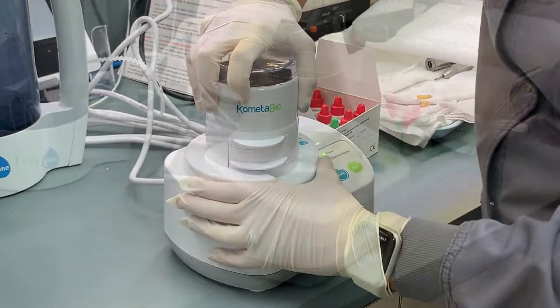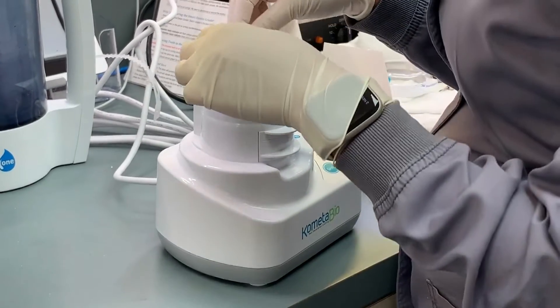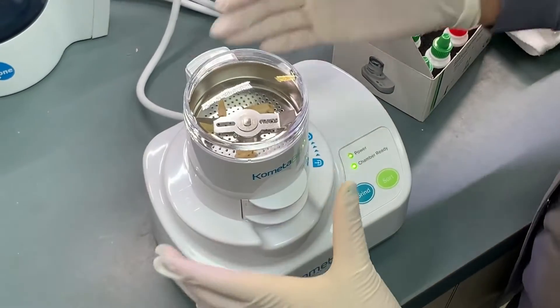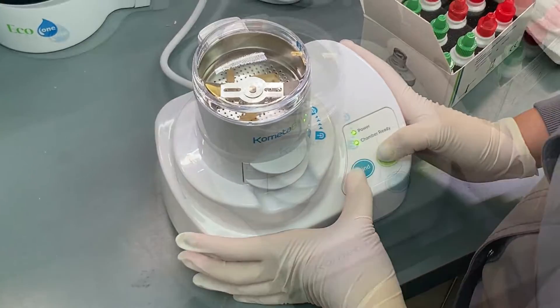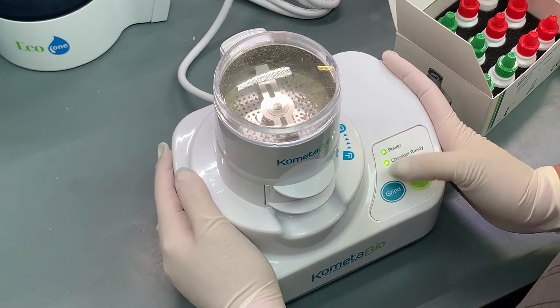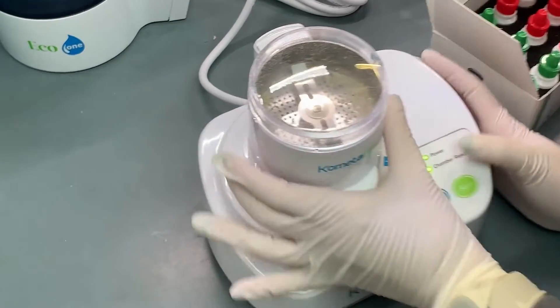You put this in and then you put your teeth in here like this and you lock it. And then you see how it's pulverizing it? You look at all the bone?